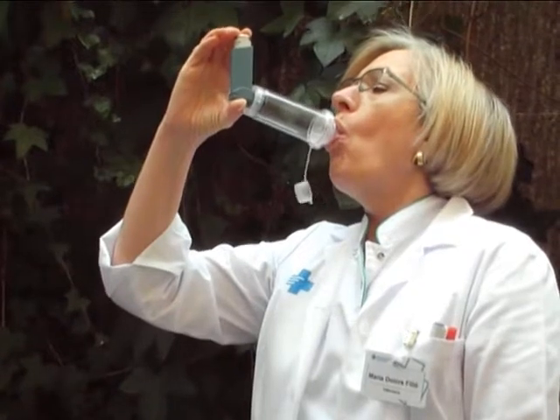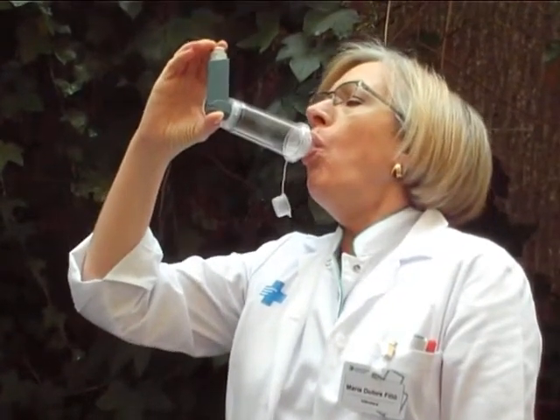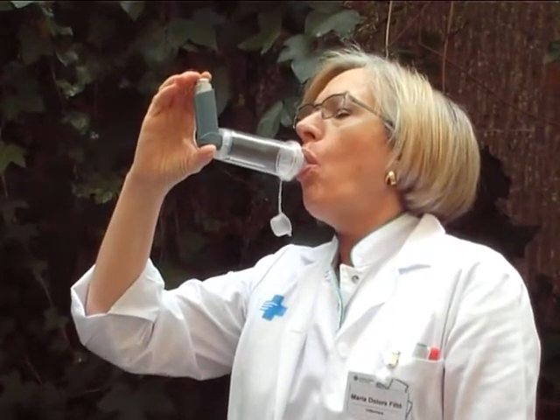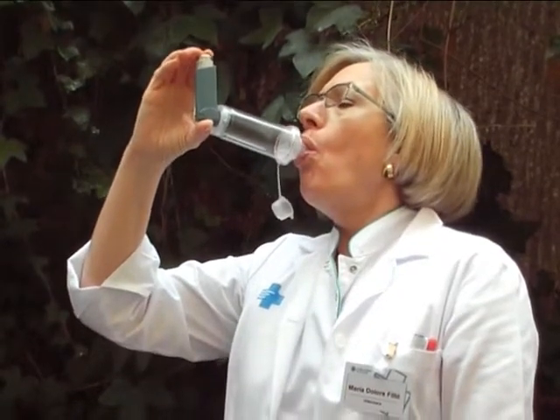Take in the air with a long deep breath. If you cannot take in the air this way, you can also breathe in and out a couple of times like you normally do, with your lips sealed to the device at all times.